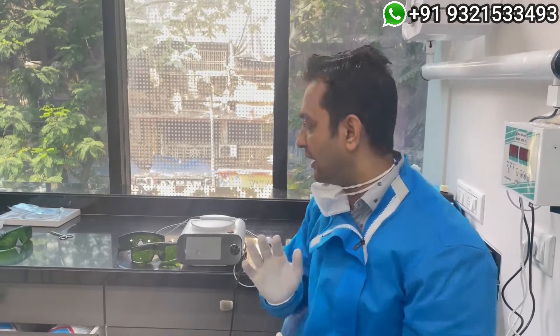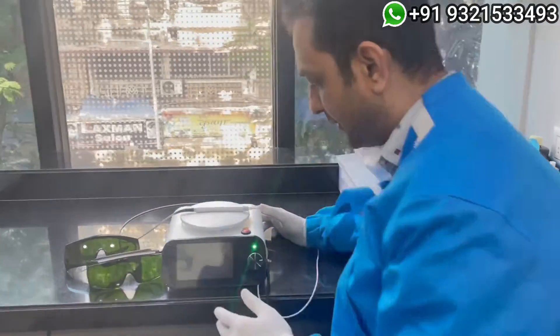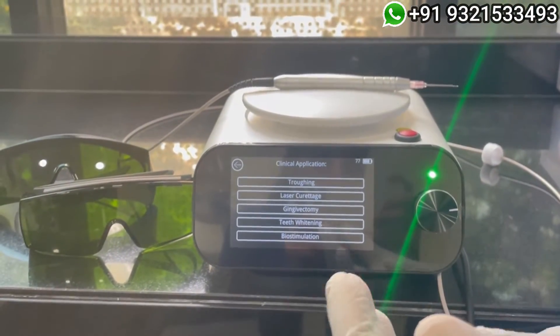Let me quickly show you this machine. It's a very nice compact machine. As you can see, it has multiple operation modes, covering all our cases like whitening and TMJ joint issues.